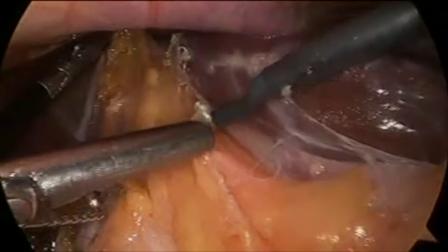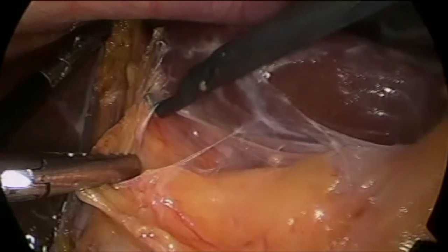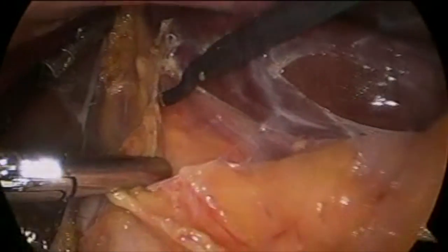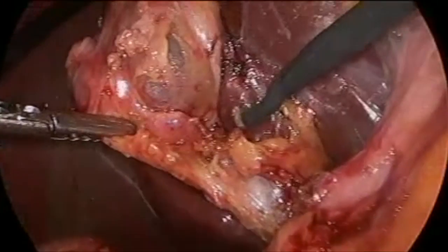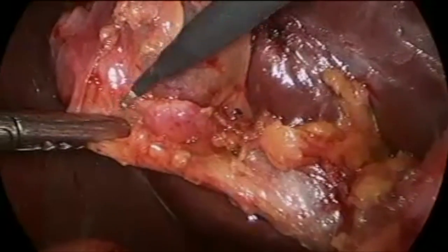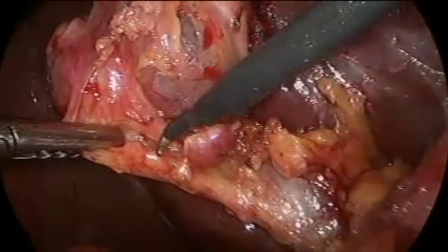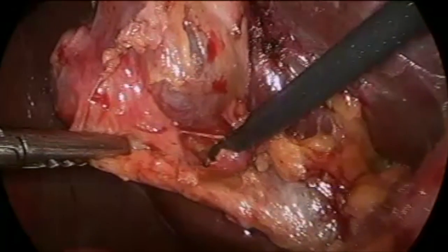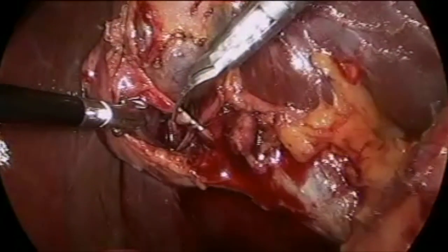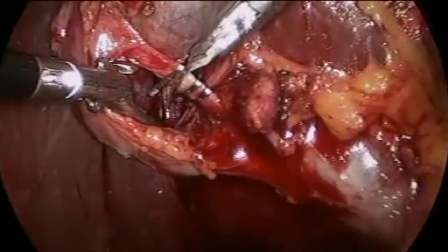The hilar plate was carefully identified so as not to damage or injure the bile duct itself. The cystic duct lymph node is identified, the structures in Calot's triangle are identified, and the critical view of safety is obtained before dividing the cystic artery.